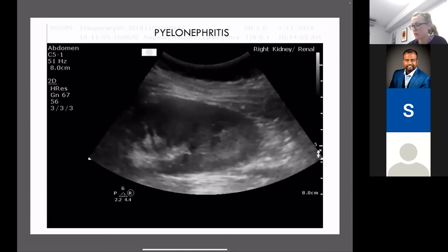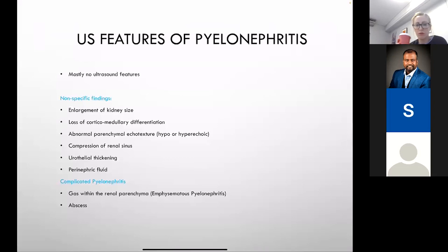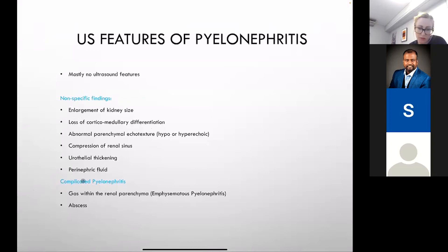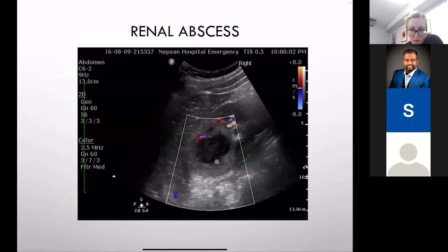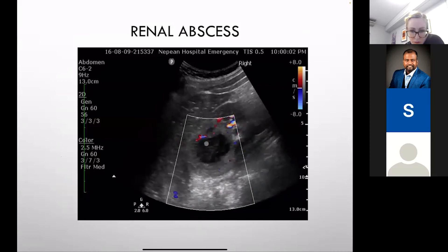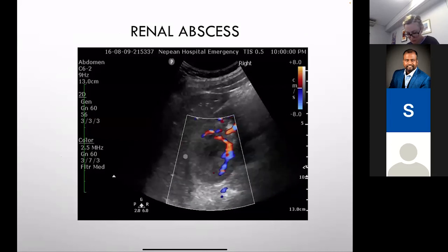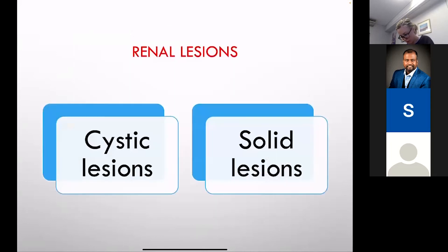In pyelonephritis, ultrasound changes are very subtle — mostly no ultrasound features whatsoever. What you might see is an enlarged kidney on the affected side, some loss of corticomedullary differentiation, and possibly a few hyper- or hypoechoic patchy changes. Urothelial thickening is in textbooks but rarely seen. What we actually use ultrasound for in pyelonephritis is to look for complications — like emphysematous pyelonephritis or abscess formation. One such example shows a heterogeneous, almost anechoic structure on the superior pole of the right kidney with surrounding inflammatory changes and vascularity — a complicated pyelonephritis that needs drainage.